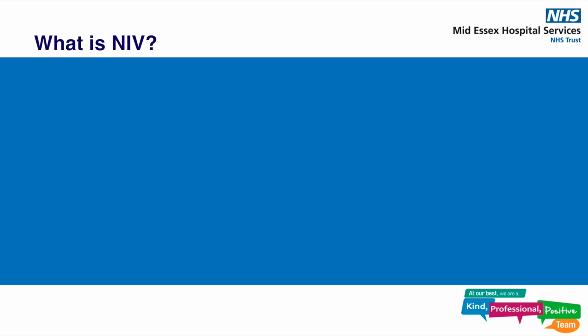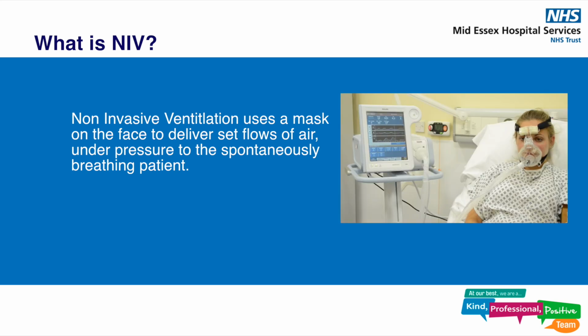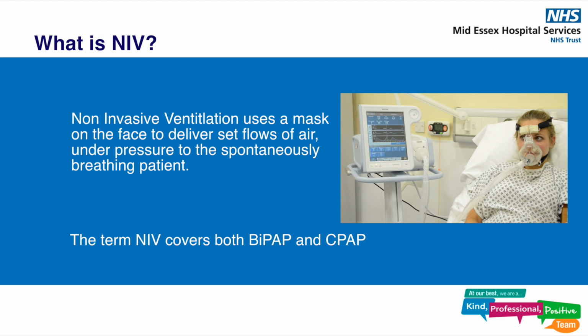What is NIV? Non-invasive ventilation uses a mask on the face to deliver set flows of air under pressure to the spontaneously breathing patient. The term NIV covers both BiPAP and CPAP.